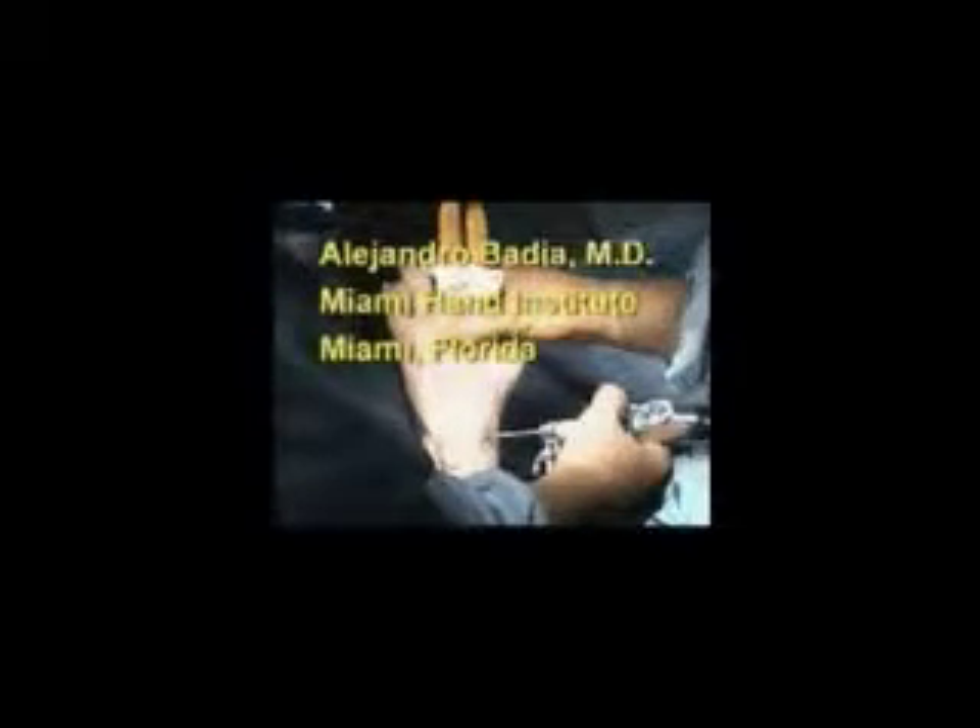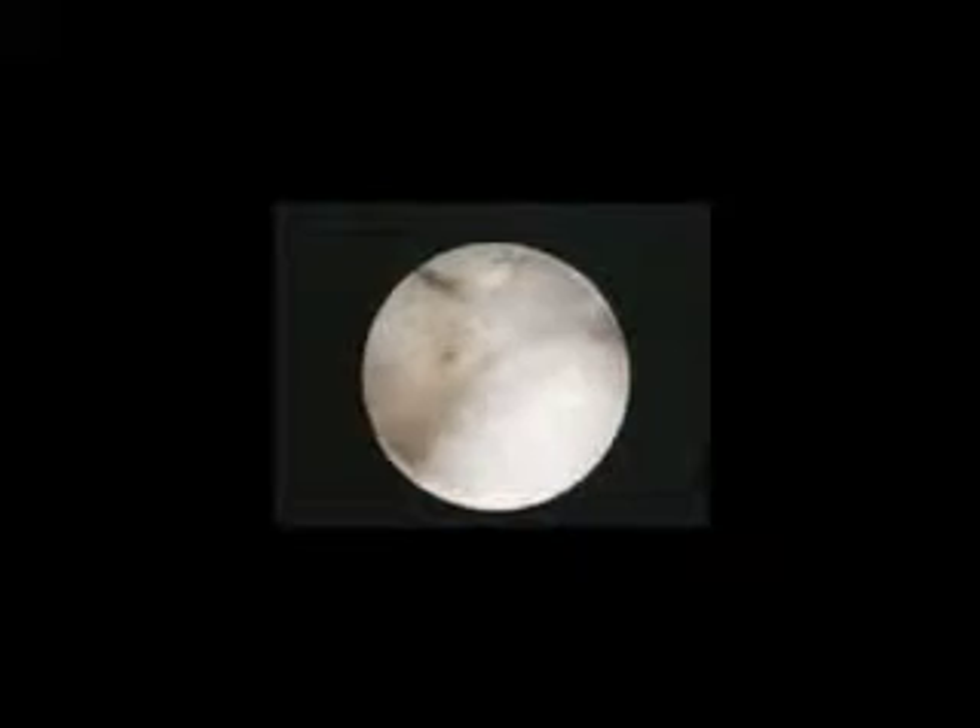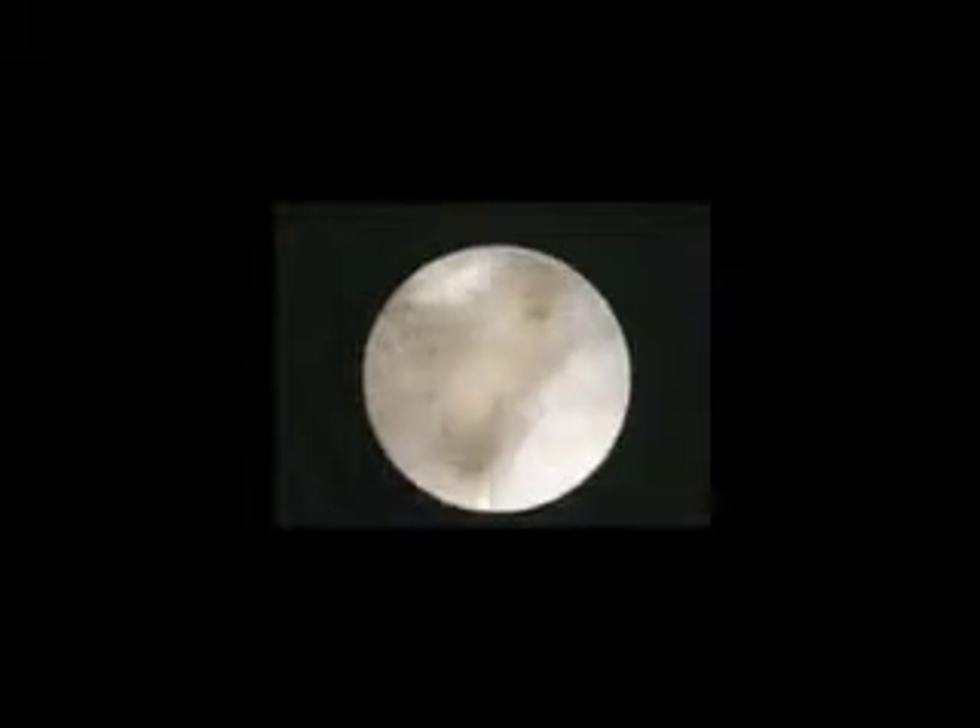This video will outline the steps used in performing arthroscopic TFCC repair using a suture welding technique. The arthroscope will be inserted in the 3-4 portal in order to demonstrate the tear seen peripherally as palpated by a probe and confirm the loss of the trampoline effect.